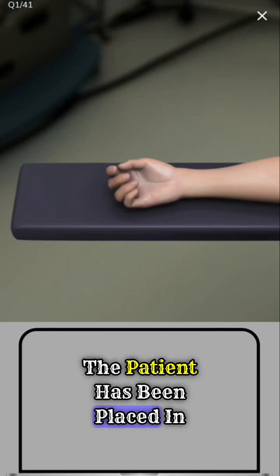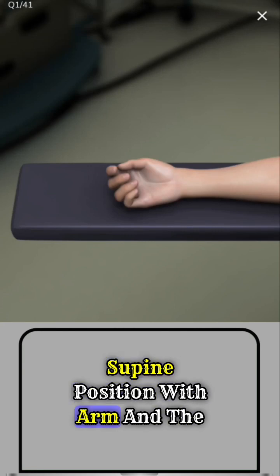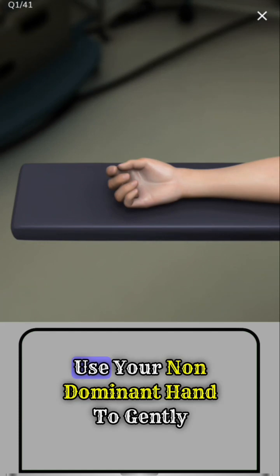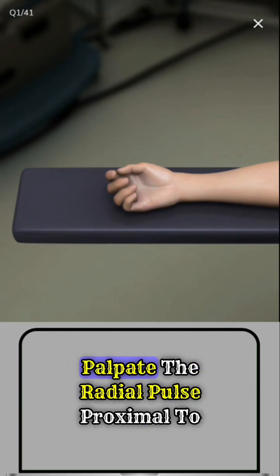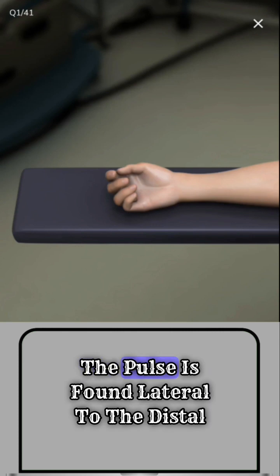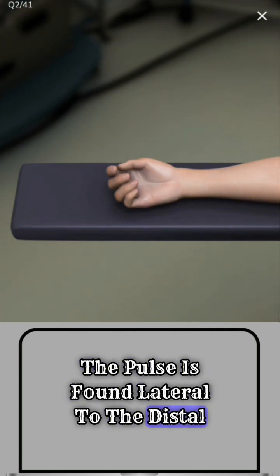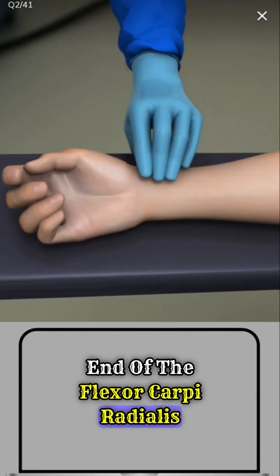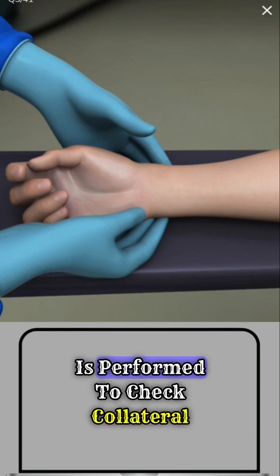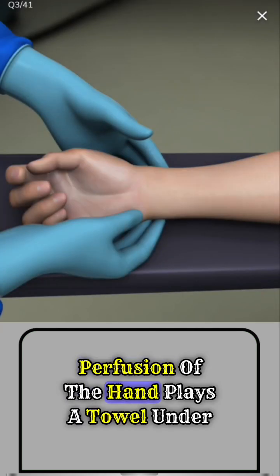The patient has been placed in supine position with arm in the anatomical position on an arm board. Use your non-dominant hand to gently palpate the radial pulse proximal to the insertion site. The pulse is found lateral to the distal end of the flexor carpi radialis tendon. Ensure at this stage that Allen's test is performed to check collateral perfusion of the hand.